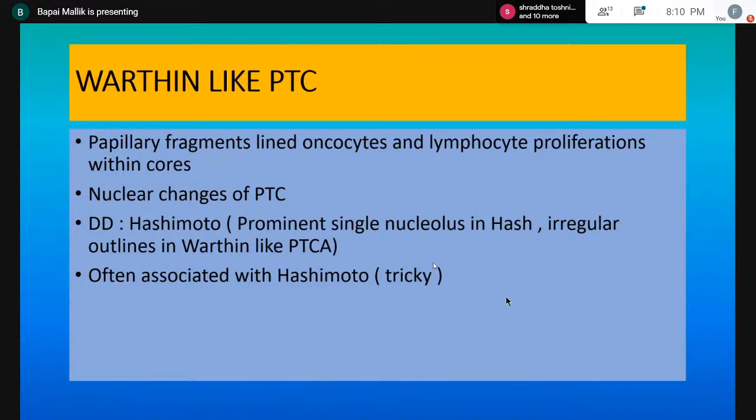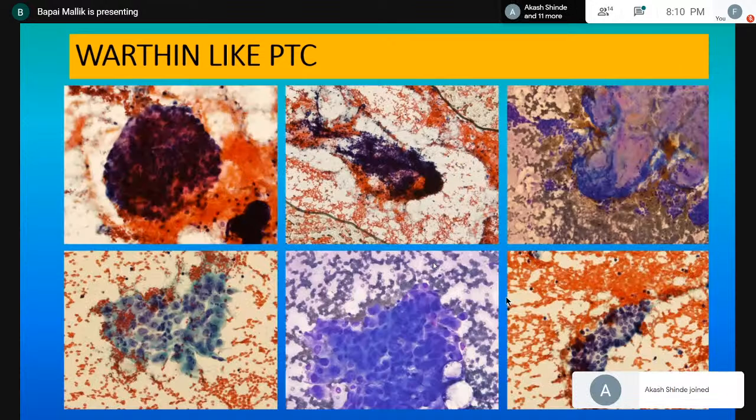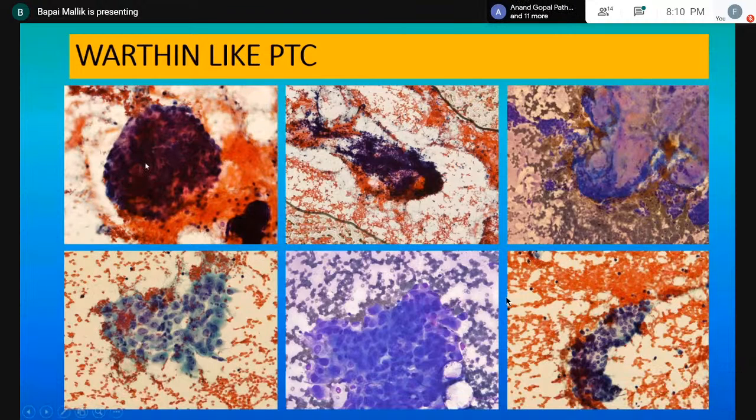Okay? And this is a set of slides. So the most important thing is what you see over here, what you would usually find in any case of an autoimmune thyroiditis. So you see these clusters of cells with very tight aggregates, almost like tissue fragments. I won't call them clusters, sorry about that. So large, tight aggregates of cells, tissue fragments, lots of lymphocytes, epithelial cells mixed with them, and then they usually show these cells, maybe showing some degree of chromatin pallor.